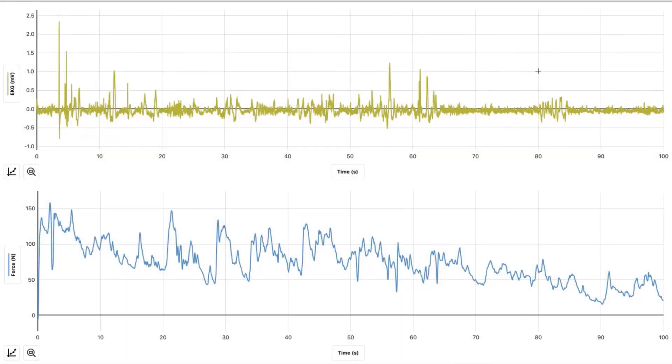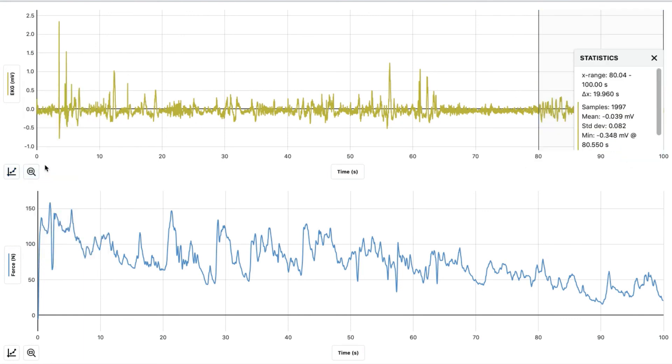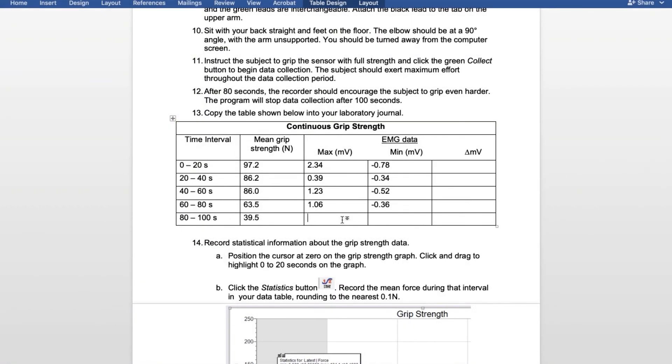And one last time, for 80 to 100 seconds, hit the graph, view statistics, and now we have the minimum and the maximum. For 80 to 100, the maximum was 0.33 and the minimum was negative 0.35.